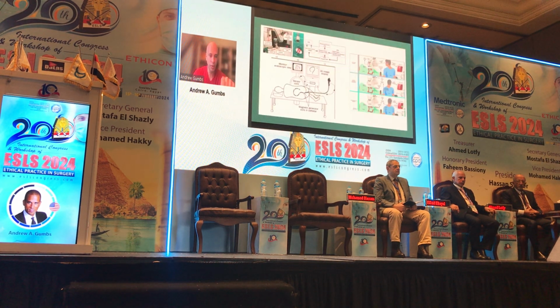But I also wanted to talk about this, where you have a colonoscope that is dragged through the colon with an external magnetic arm that is pulling it through. So multiple teams are working on this. One of these papers, the image on the right, was published in Nature. So as you can see, autonomous endoscopic navigation is very, very real and is being developed at a lightning pace.